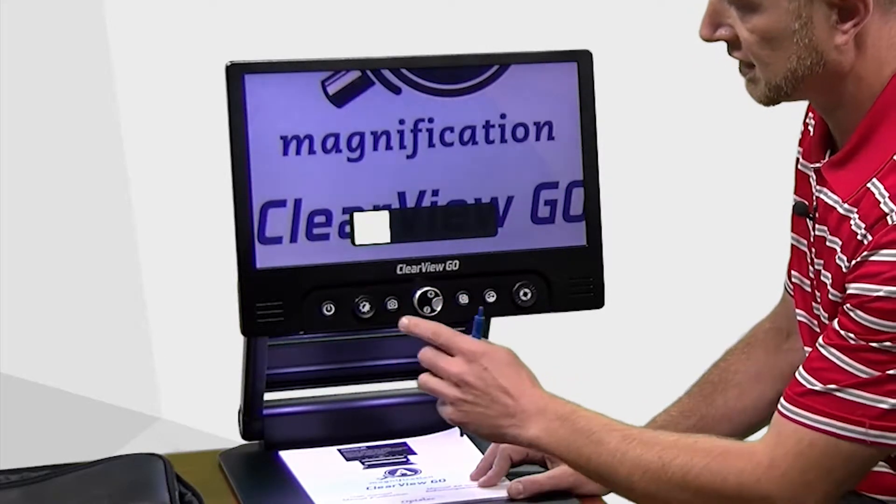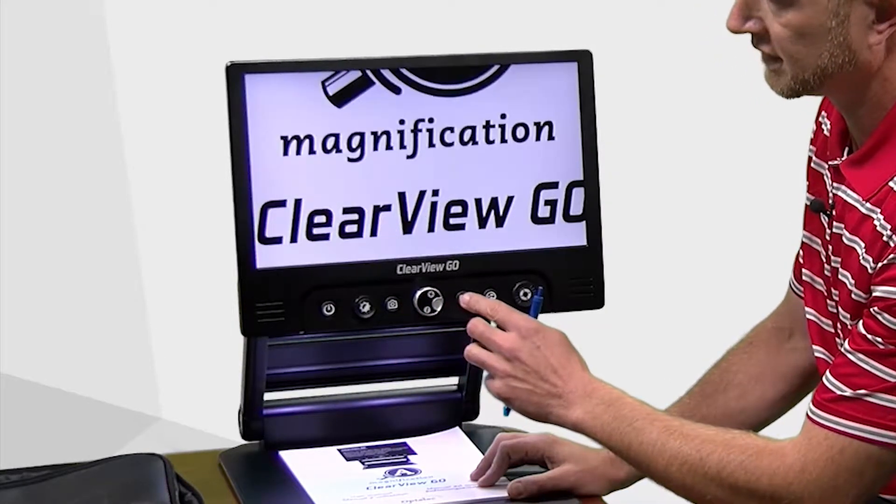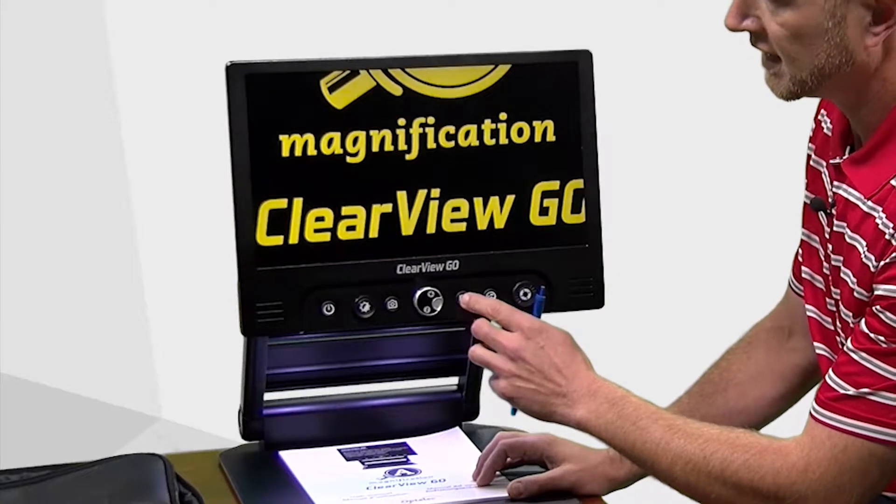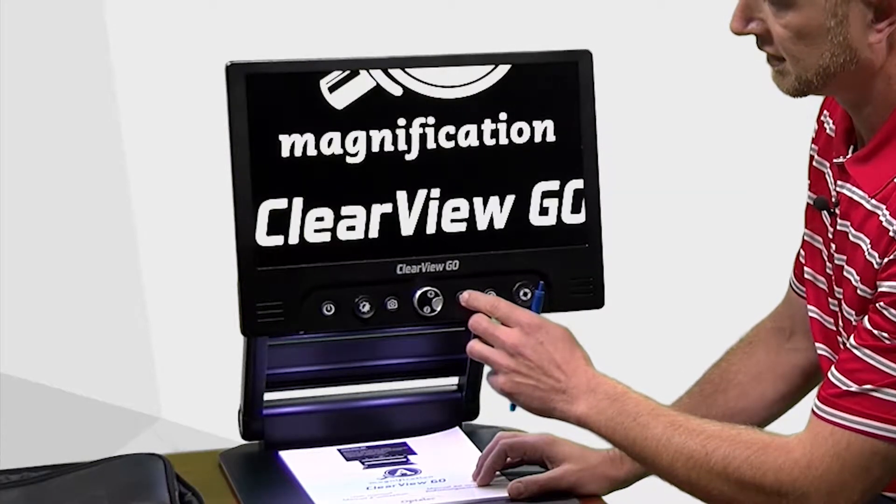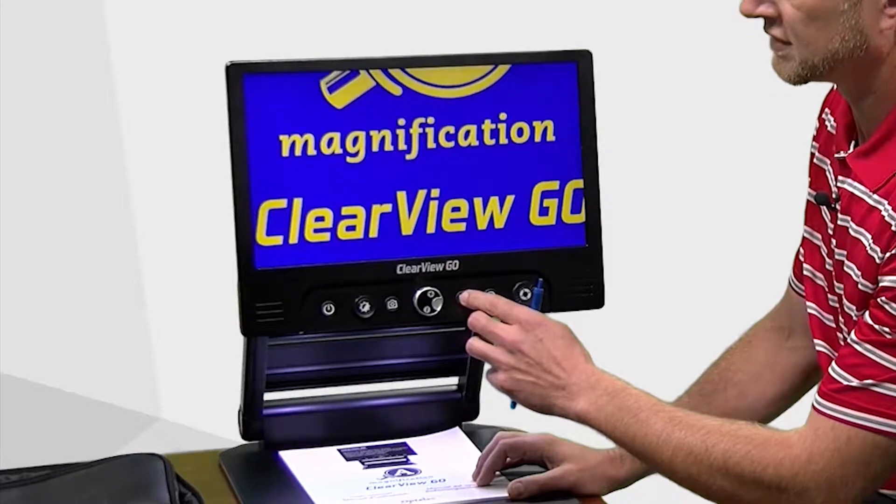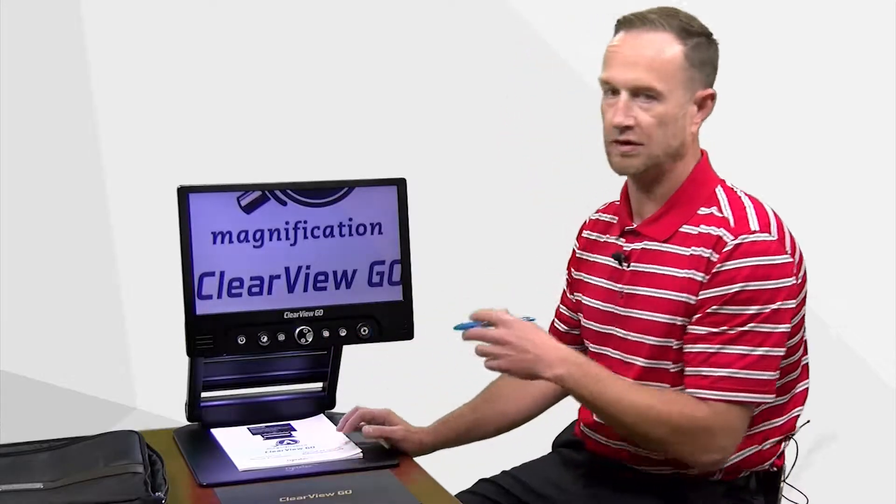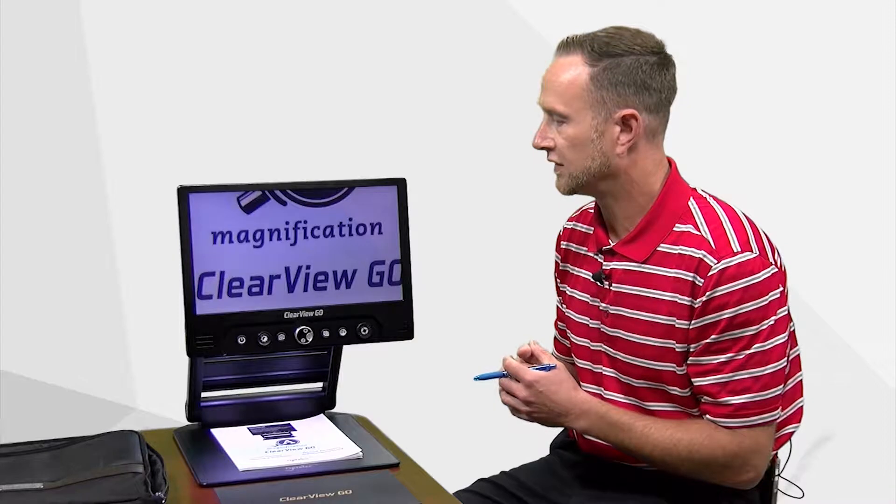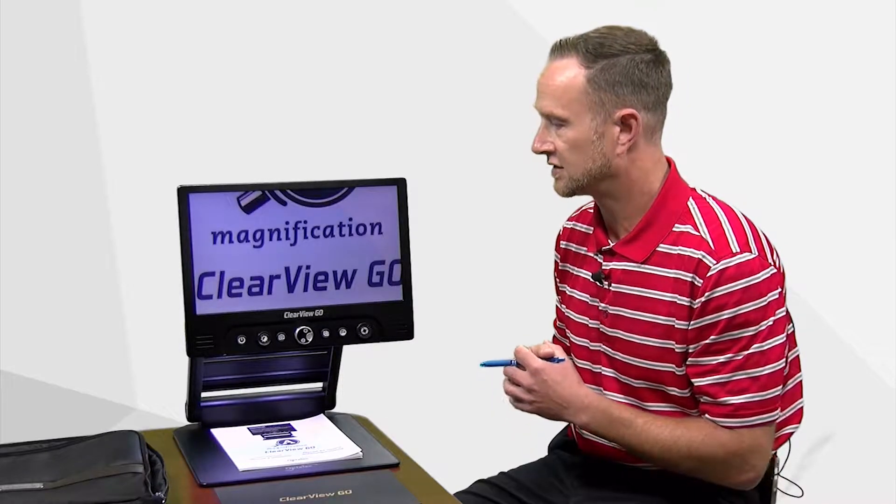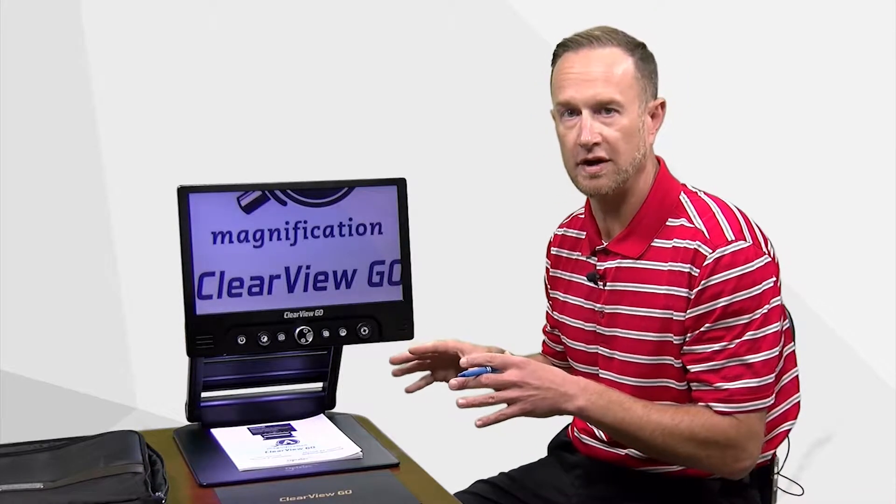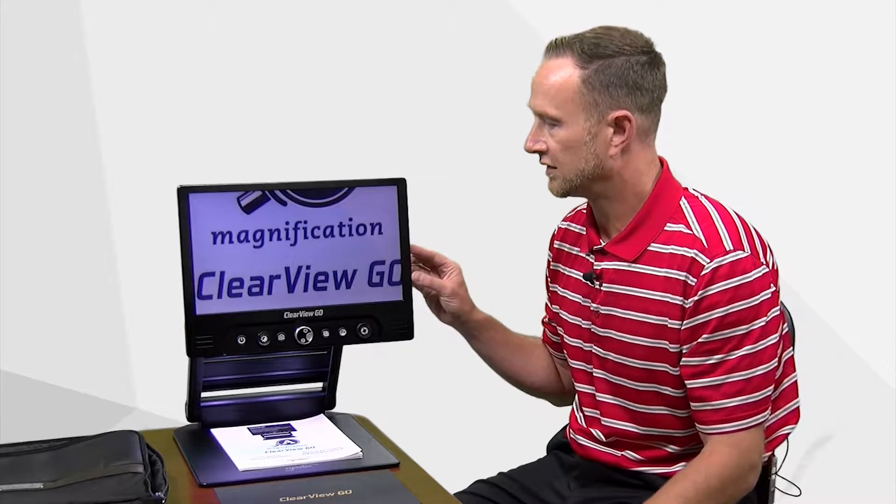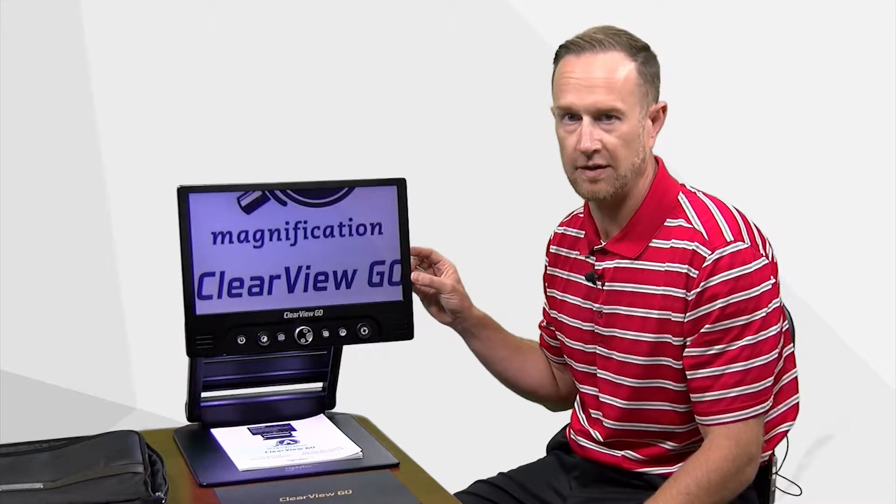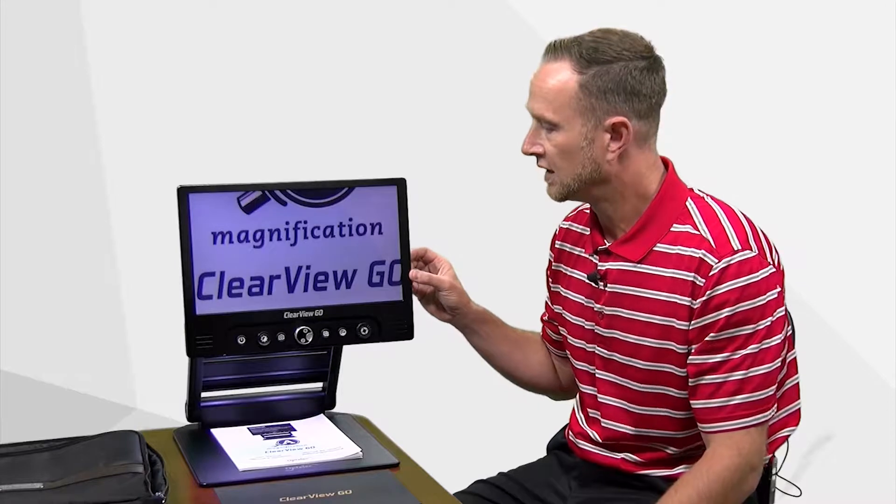You can change the color contrast here to a variety of different color contrasts. The image quality of the Clear View Go is second to none. We work with a lot of different video magnifiers and especially in terms of portable video magnifiers, the image quality is absolutely phenomenal, which is incredibly important.